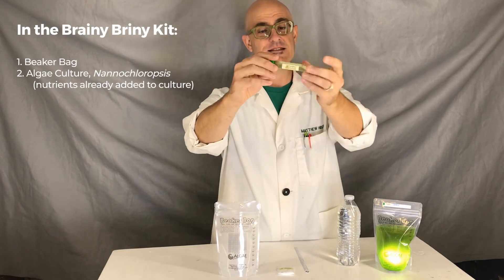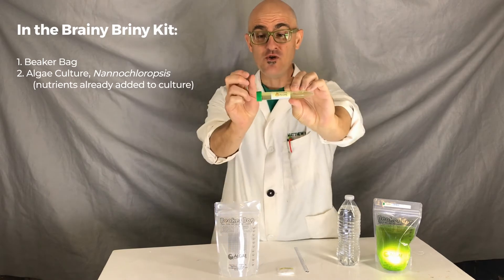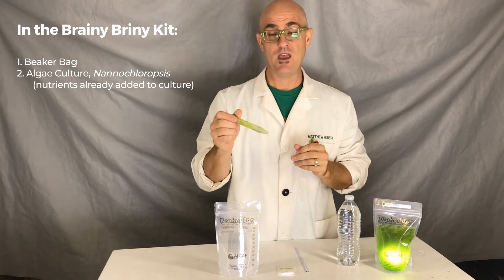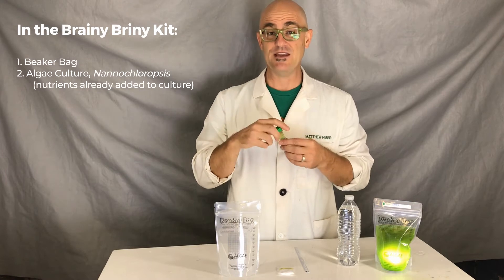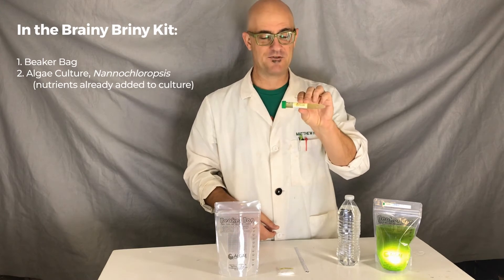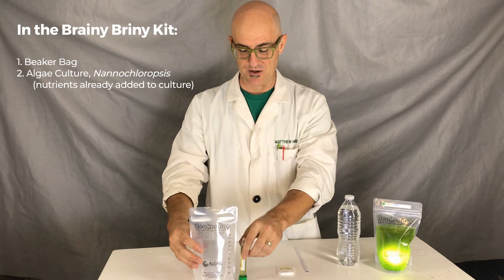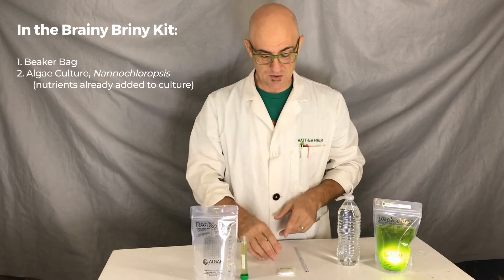This is algae culture — a strain called nannochloropsis. This microalgae is about two microns in diameter; they're super small in the microalgae world. Bacteria are pretty much the only organism that's going to be smaller than this. They grow fast and can get nutrients really well from their surroundings. We actually add nutrients to this container, so all of the fertilizer you need to grow the algae is already right here — no extra stuff needed. This nannochloropsis is a saltwater-loving algae, so it's marine.